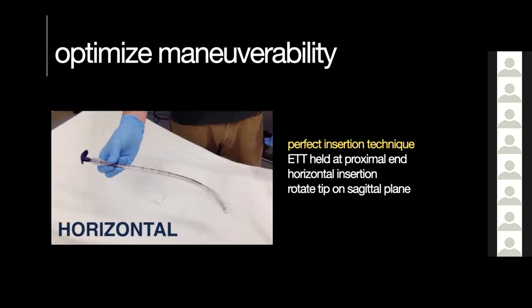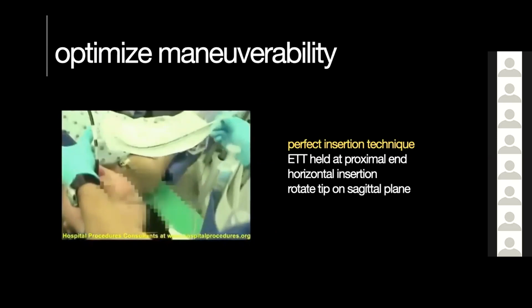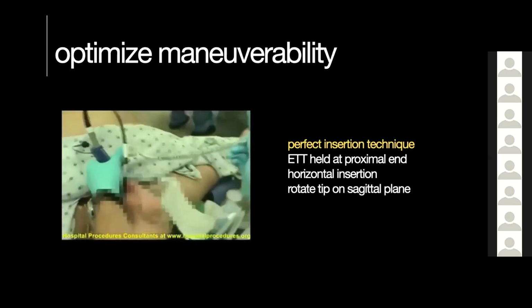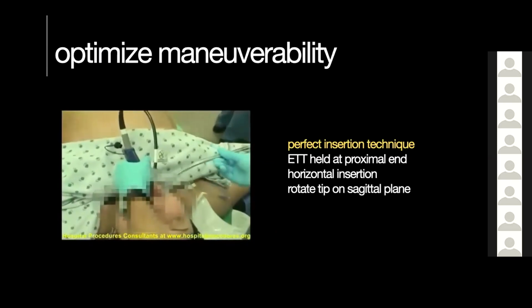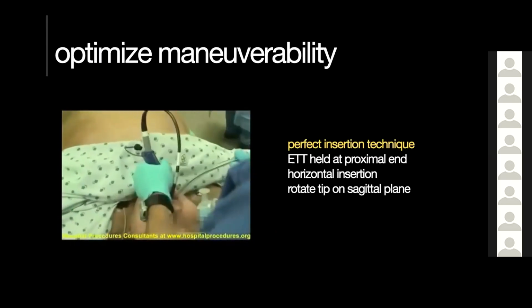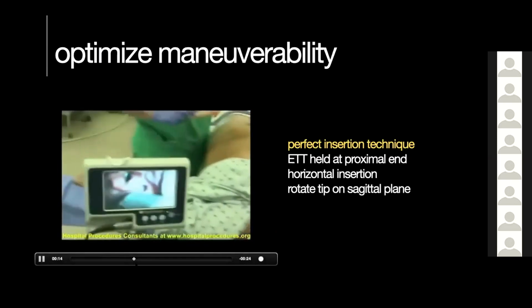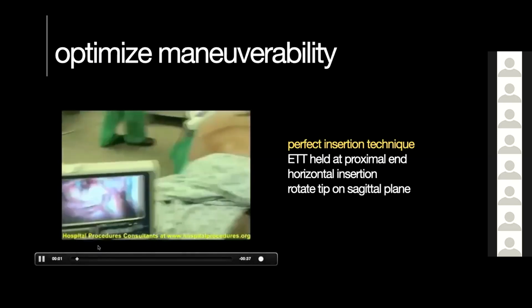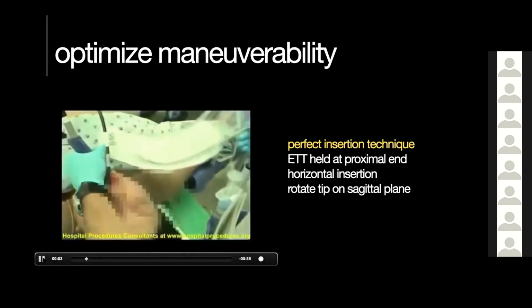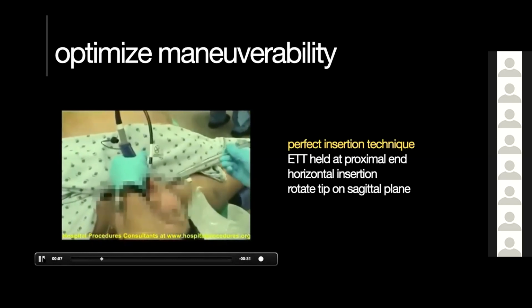That's it. And the insertion, I hope I have a picture about this. Yes, so we're going to have a look at it here. This is the perfect insertion technique. Look at how he's entering with the ET tube. Very good. So the ET tube, if we go back to the video, I'm just going to go back here. And I'm going to pause it right here. So removing that little plastic thing. And I'm going to stop right here.